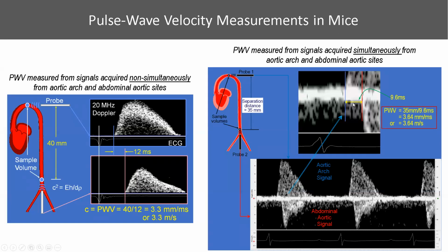Using this timing, if you're doing interventions, you could have transients as the drug wears away, but you're looking at the same pulse. That way you don't have to worry about the ECG timing changing and affecting this measurement. So when you have simultaneous probes, you get the measurement in one shot. You don't have to depend on the ECG timing. So that's my last slide.